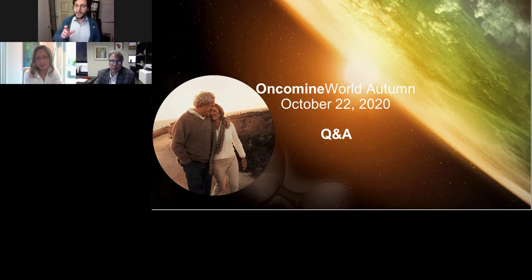The first question is about the comparison that you have shown between the Oncomine Comprehensive V3 and the Plus. The question is about the input material that you have used. I guess the answer is yes, but this is the question coming in: you used exactly the same input for both assays, or the input was different? No, we use exactly the same input.